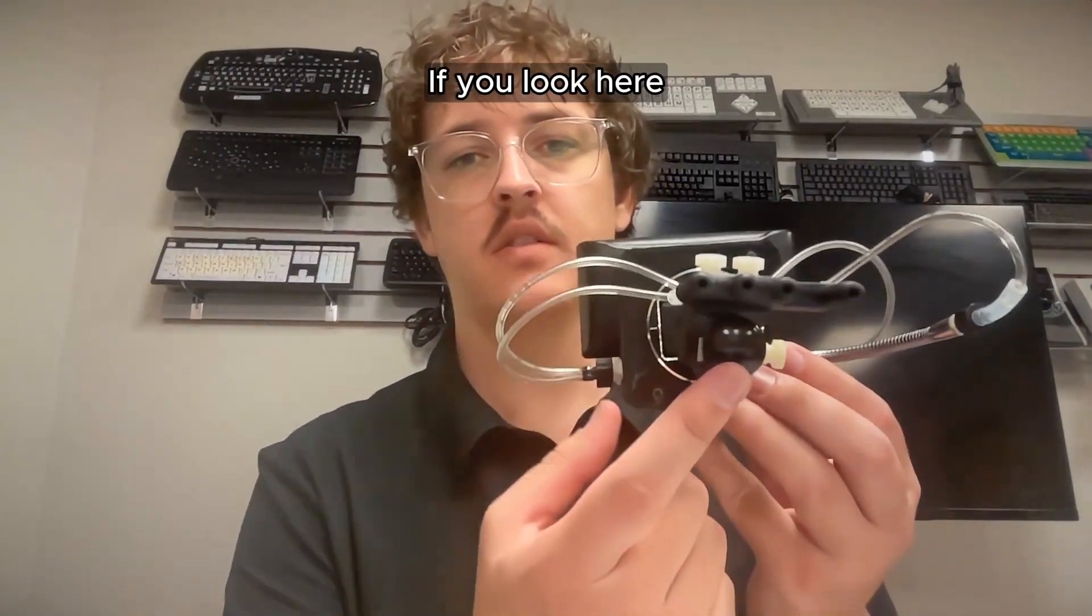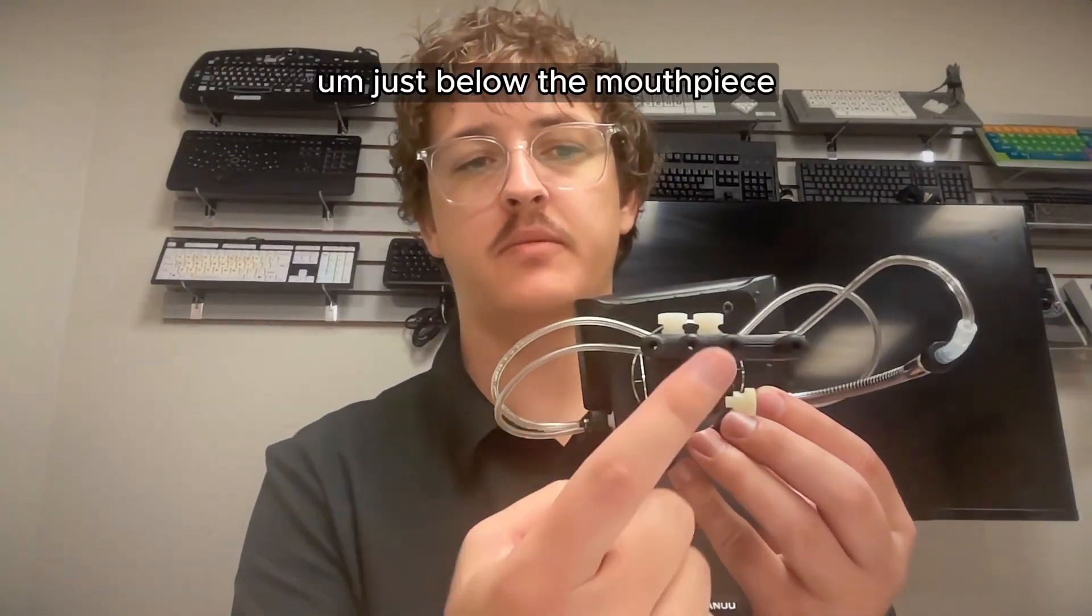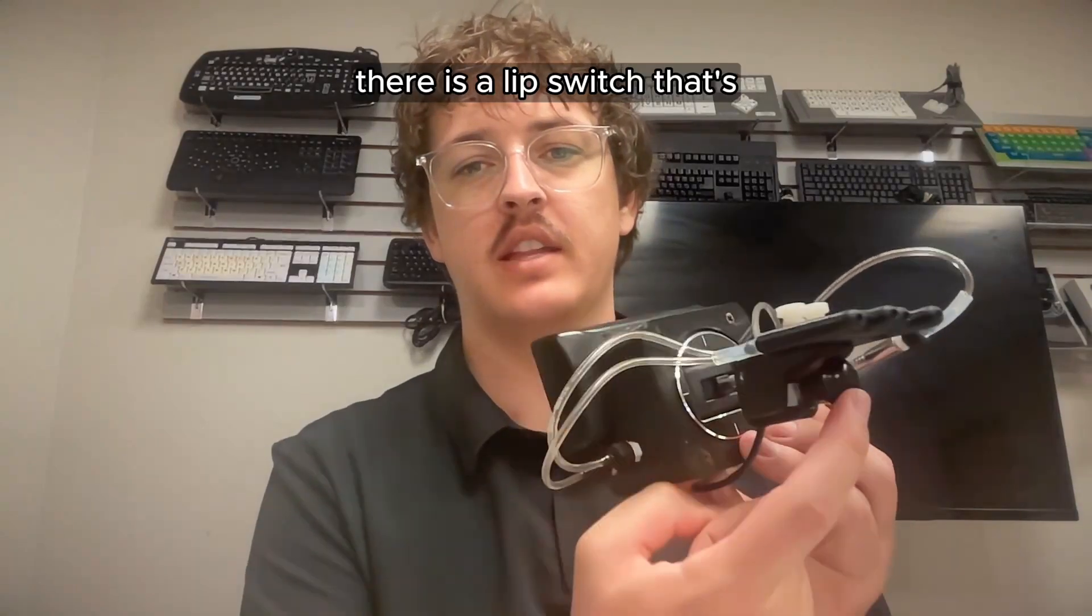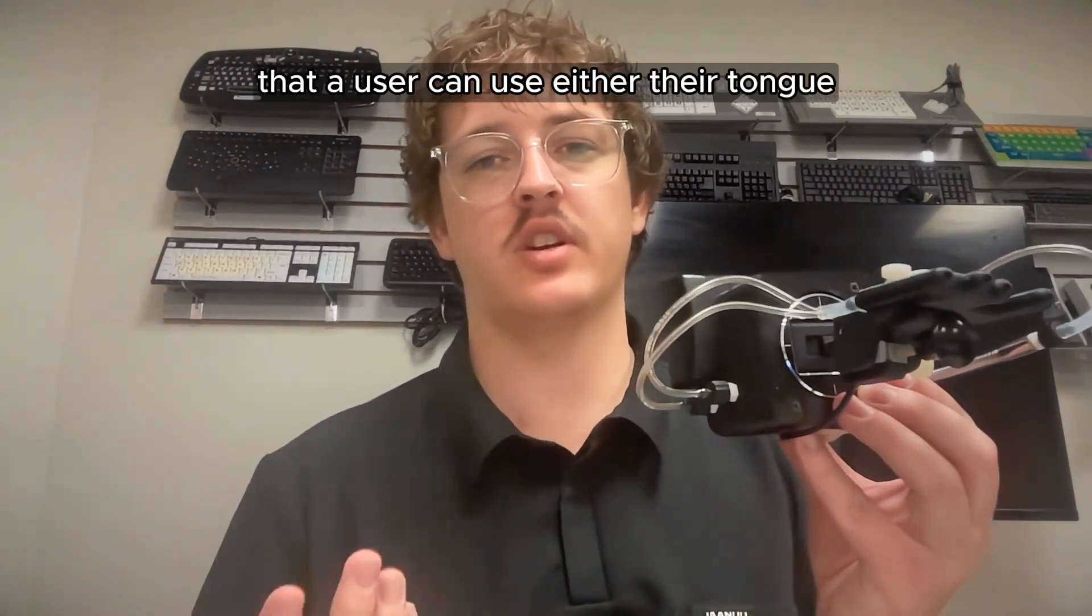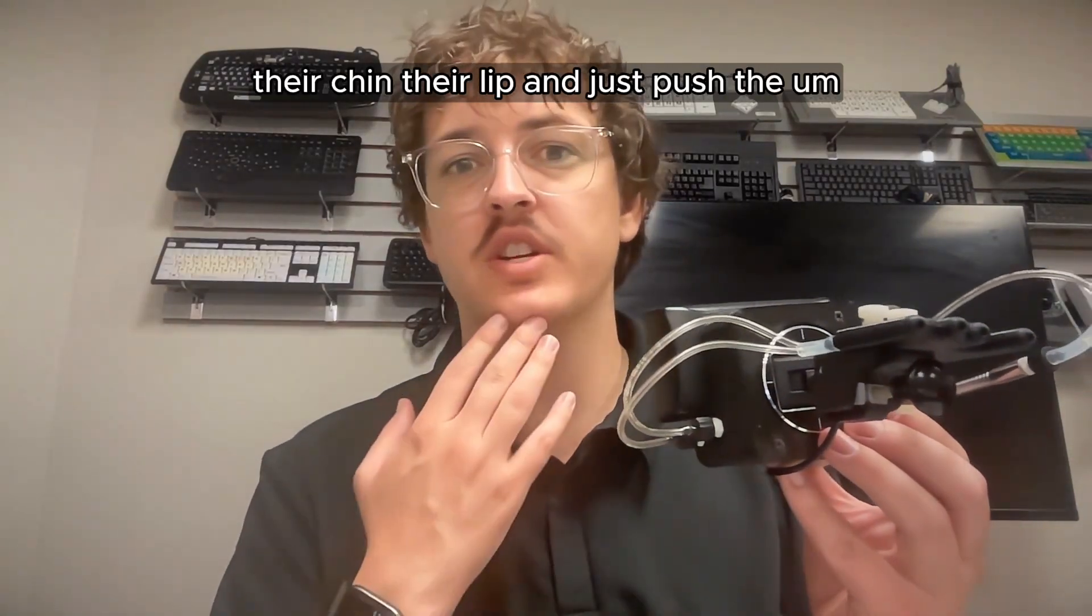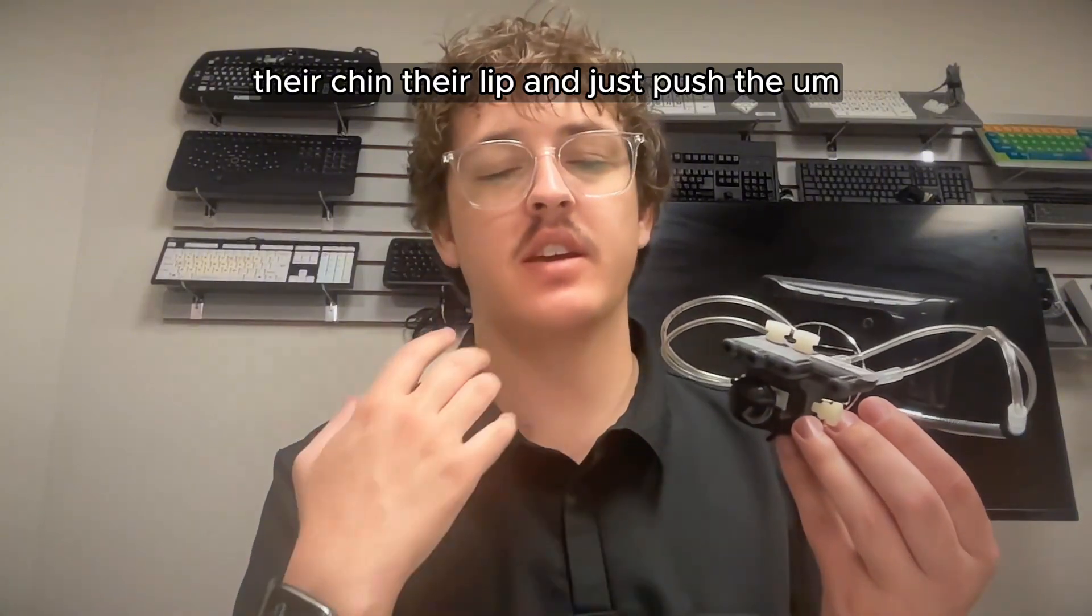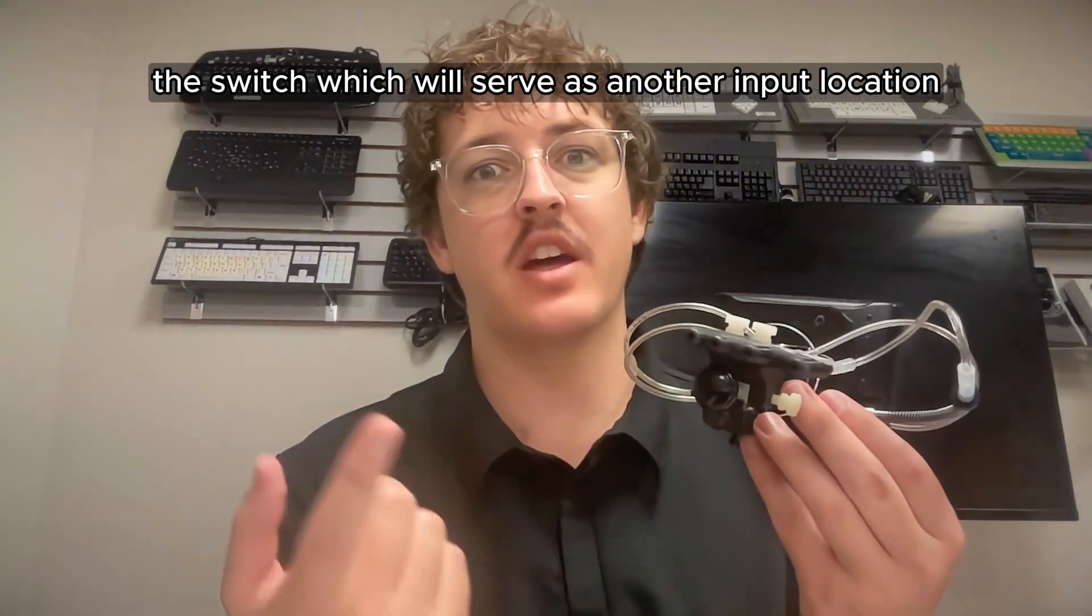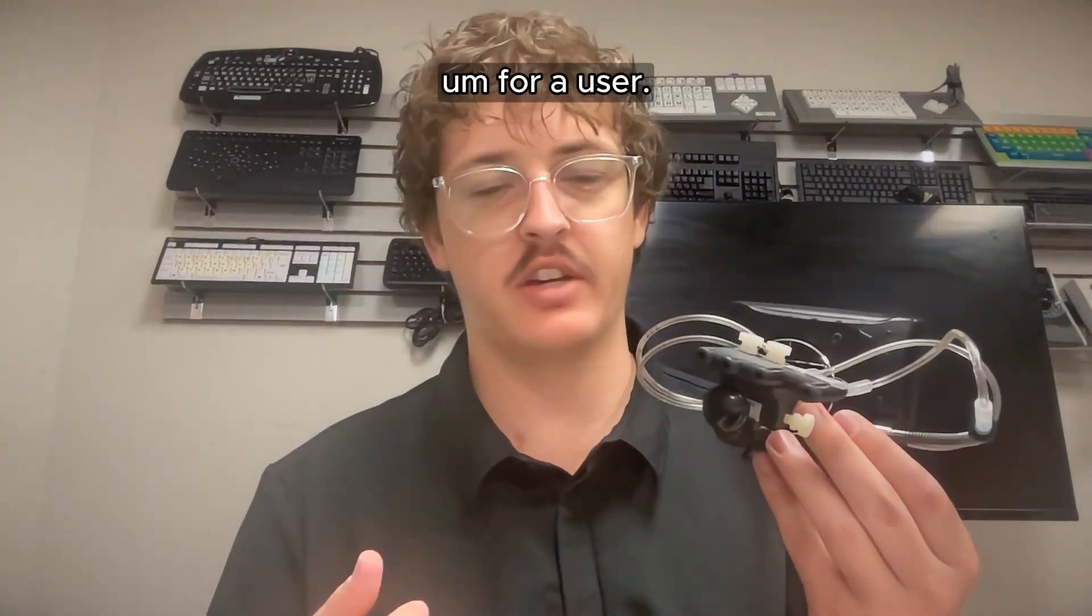Just below the mouthpiece, there is a lip switch that a user can use either their tongue, their chin, their lip, and just push the switch, which will serve as another input location for a user.